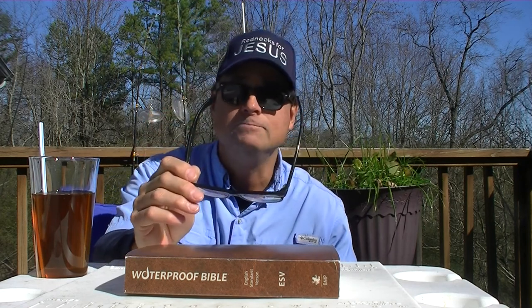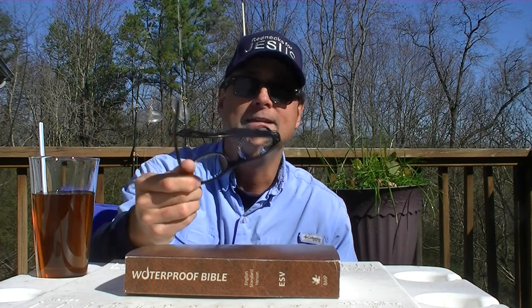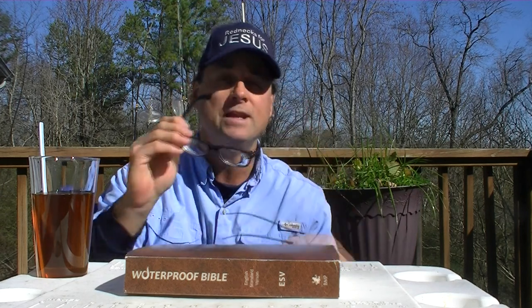My two sons also have Ray-Ban Wayfarer frames with prescription lenses, and they just hold up — they don't break. I could have a pair of frames, have clear lenses put in them, and then when my prescription changes a couple years later, I go back and have new lenses put in the same frames because they're so tough, they just last and last.